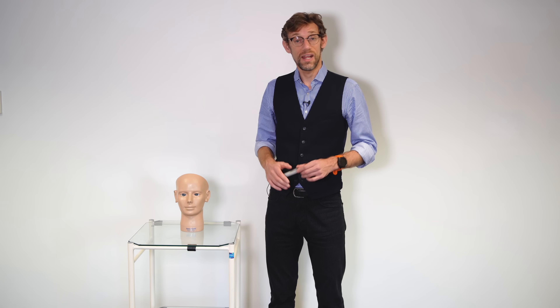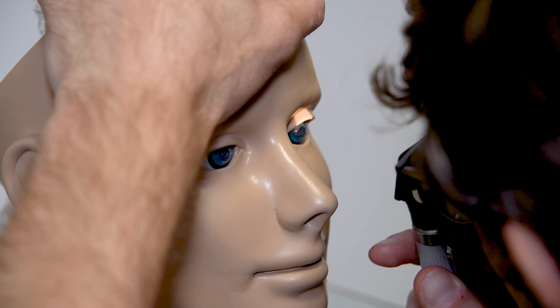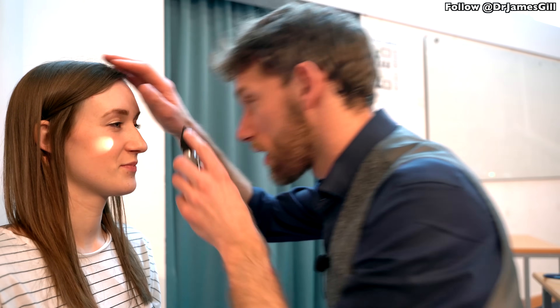We've confirmed what we're going to do and we highlight to the patient that we will approach them very closely, nearly putting our head toward theirs. That's important because whilst we won't be dilating their eyes, we will be lowering the lights in the room. We're going to approach the patient using our left eye to their left eye so that our faces cross without problems. I had optic neuritis as a baby and that eye is ever so slightly affected, so I'll tend to use the same eye on both sides of the patient, although I highlight that because I have to get a little bit closer than would be ideal.